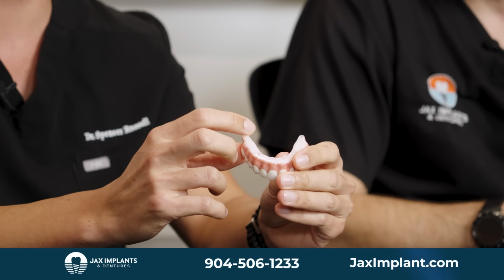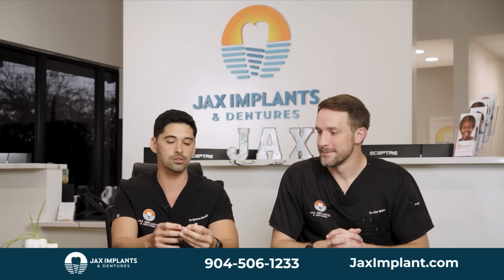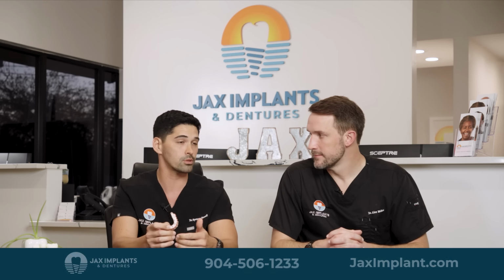It's so incredibly smooth. It's like a glass-like finish here, and nothing sticks to it. As long as you're doing what you should at home, cleaning it with a water pick, it's going to stay like that. I've had these in patients' mouths for years and years, and sometimes we've taken them out, and it literally looks exactly like this when you take it out. So that's really the biggest benefit to having that zirconia there.